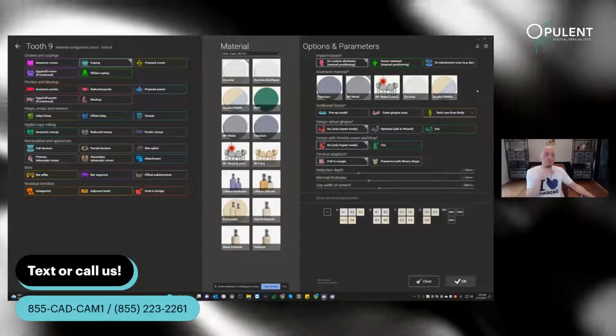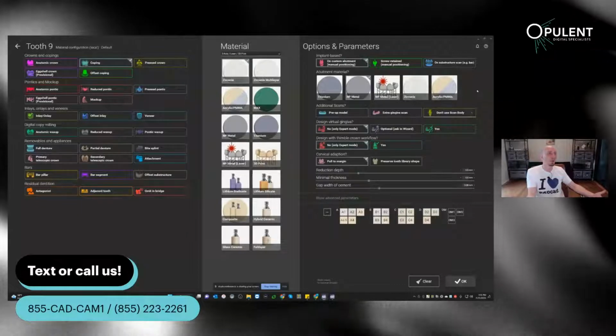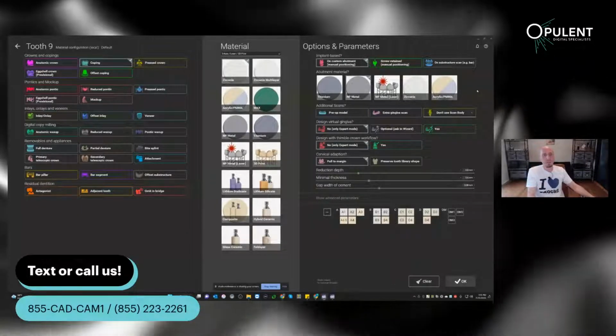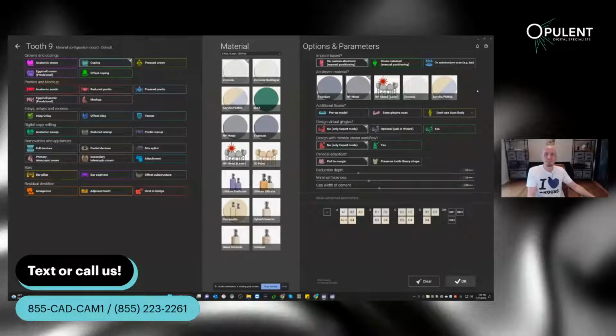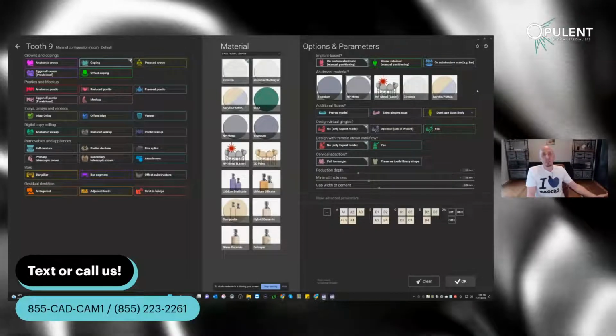You think you are doing everything right, you're doing your homework, you're looking into whether your doctor has the correct scan body. Maybe you're even providing scan bodies. I've heard some people doing that, giving scan bodies to your doctor to make sure that they're using the right kind, and that your life is going to be easier.